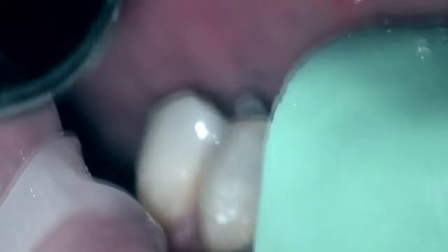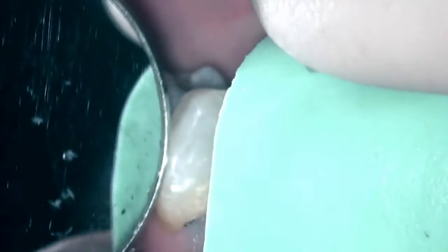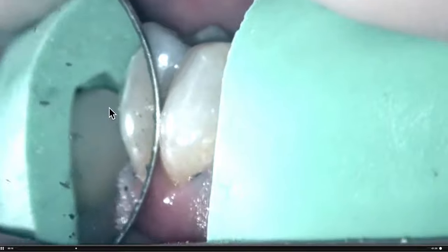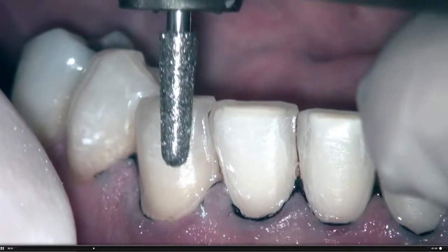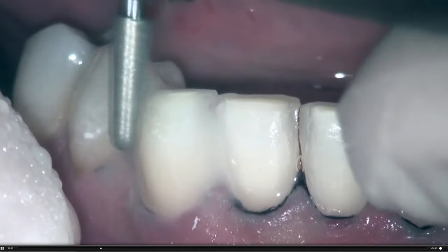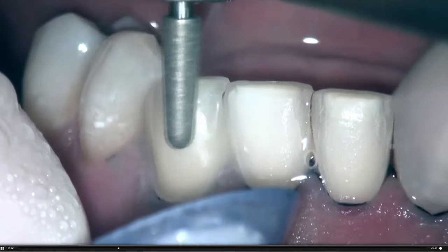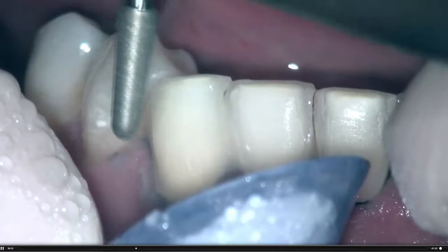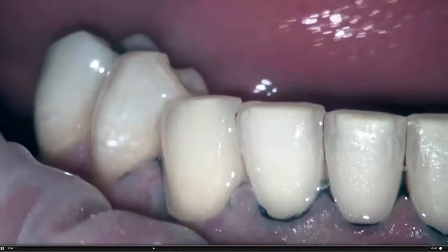Here's the putty in place on a lower cuspid. I have reduced the lower cuspid a little less than we would like in the incisal third and body third of the preparation. I'm going to use this large KS diamond because I'm just trying to get a little bit more body third space for the porcelain veneer. The outside wall of that putty was the diagnostic wax-up, which represents where we want to go.